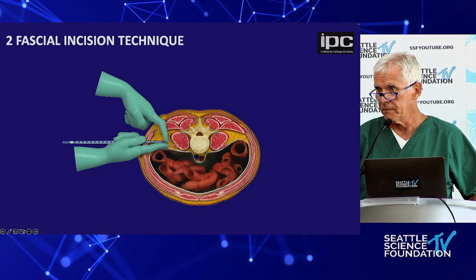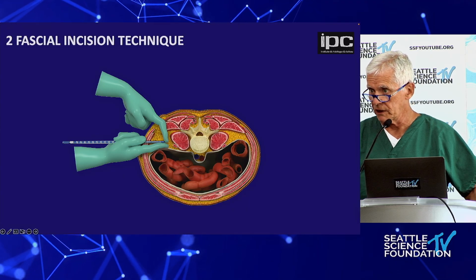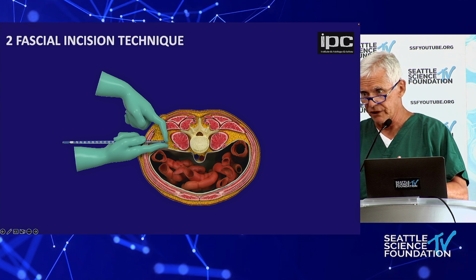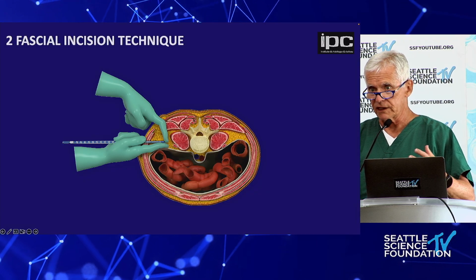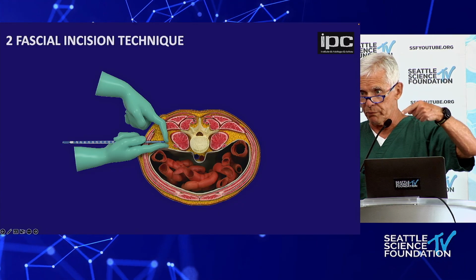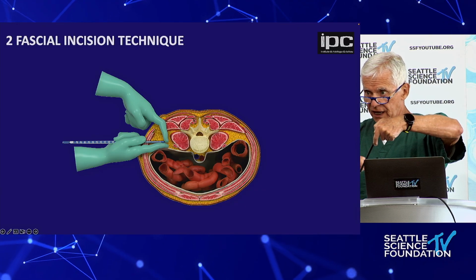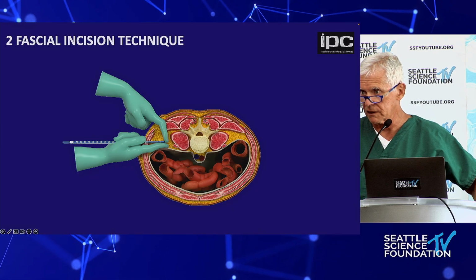I'm used to saying that people are afraid of big patients. I always say big patients means more fat, which means also a bigger retroperitoneal space, which makes it safer. It's more difficult because of the length of the retractor, but on the other side, it's very easy to reach the retroperitoneal space, and when you go posterior, sometimes the full hand goes under the skin for the first fascia incision, and then you work in the direction of your finger again to the psoas muscle.